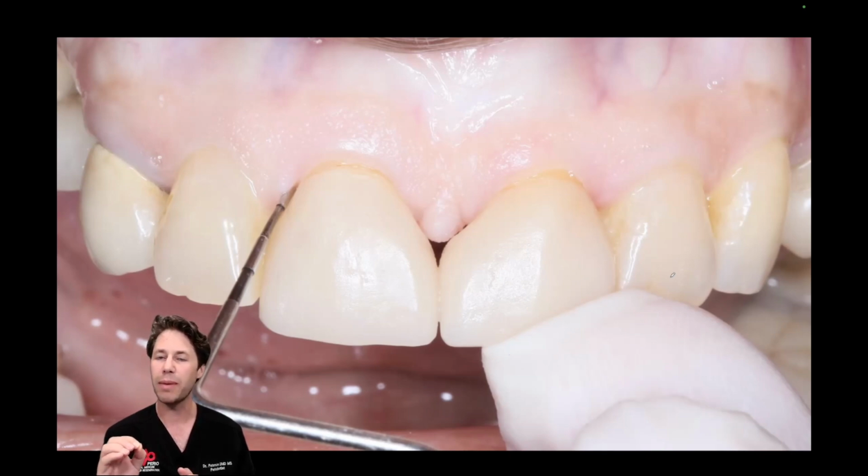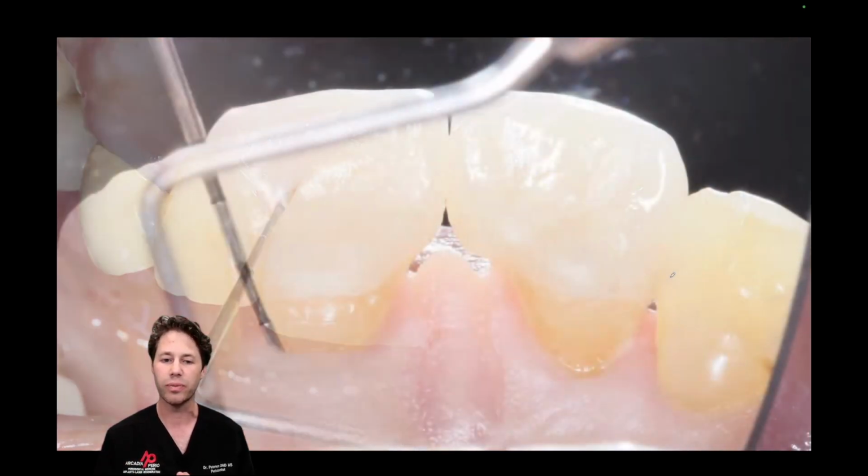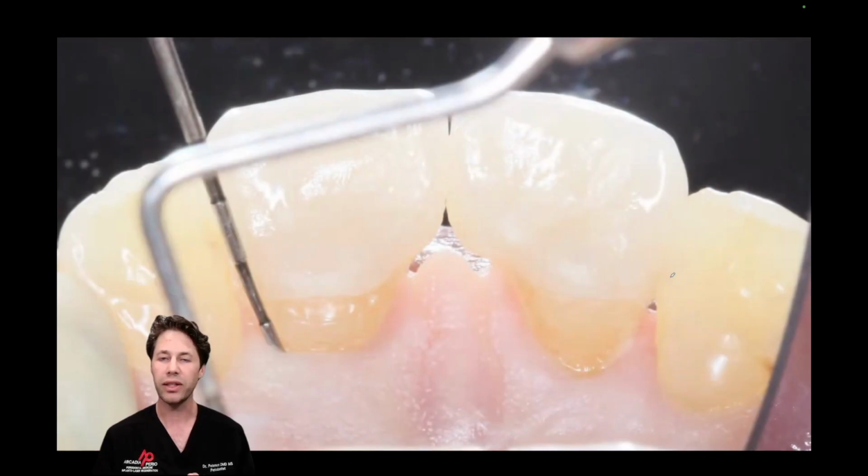No matter what type of flap reflection you do, there will be some type of tissue shrinkage and loss of papilla interproximally. This will not happen with the Periolase MVP7 laser. Look at the lingual aspect, or the palatal aspect. Again, the tissue blanches. I can tell you I'm probing firmly.